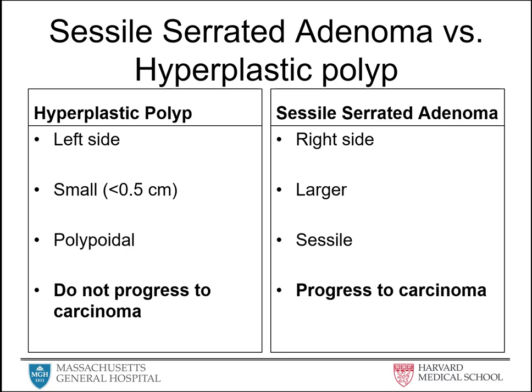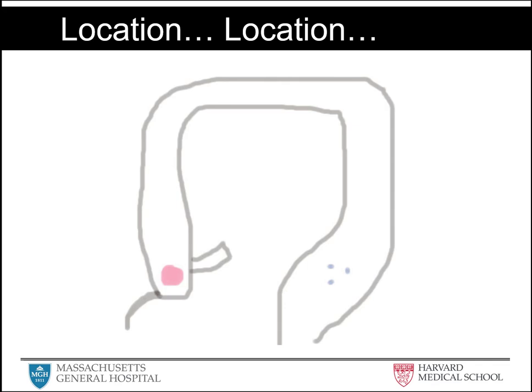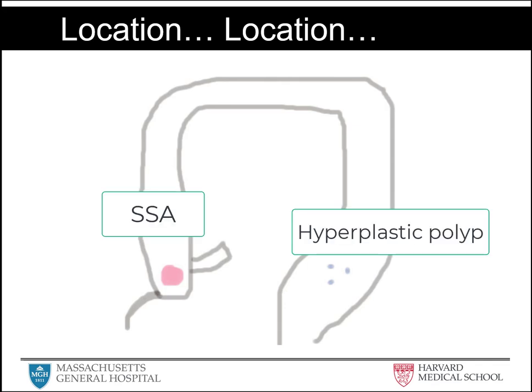So here's a quick comparison between these two polyps. Location helps, size helps, but ultimately it is your judgment under the microscope.